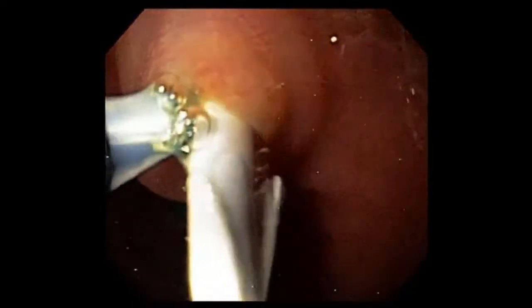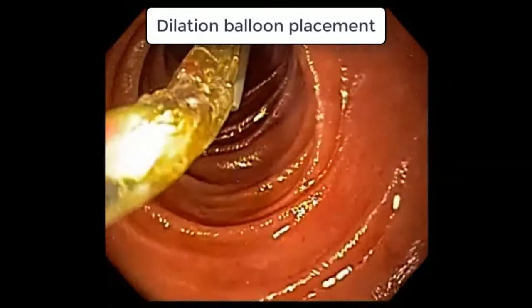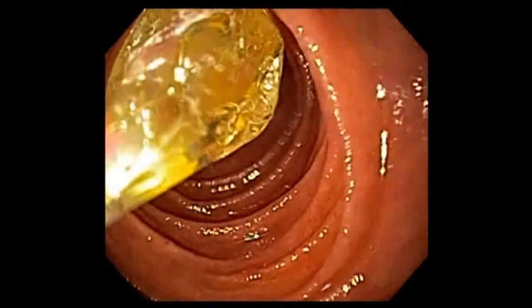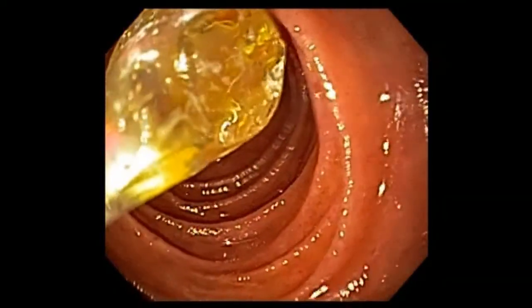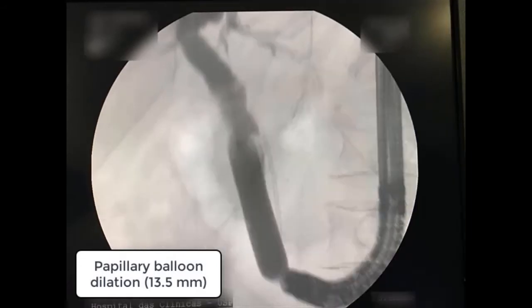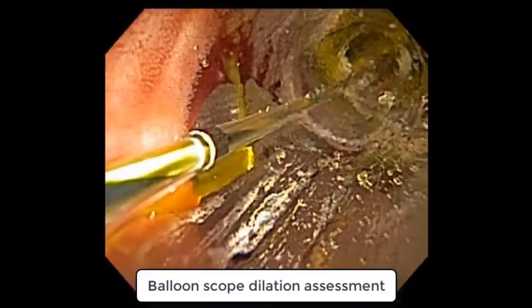Contrast injection showed a quite large stone, and due to the challenging position, the decision was made to proceed with balloon sphincteroplasty. The balloon was inflated under endoscopic and fluoroscopic guidance until the disruption of the radiological waist. In some cases, endoscopic visualization may be helpful to reduce the risk of adverse events.